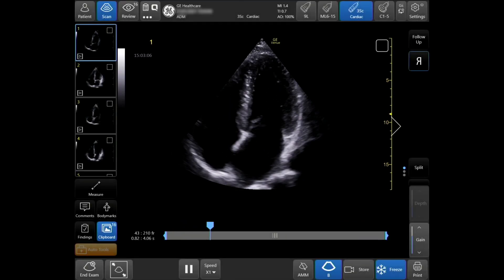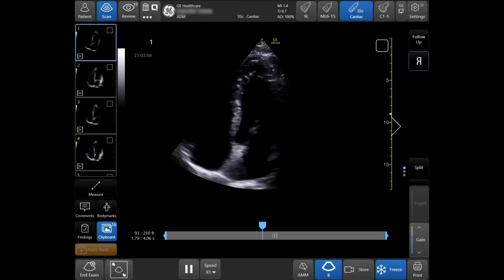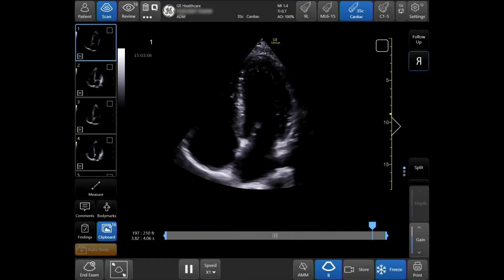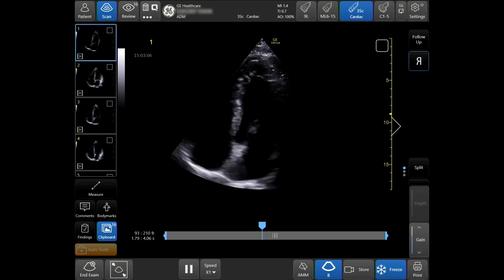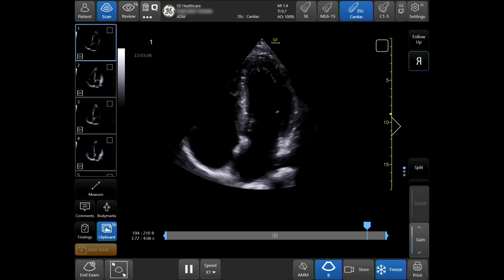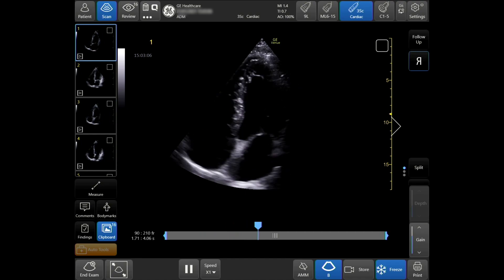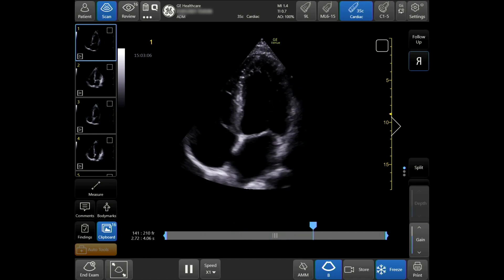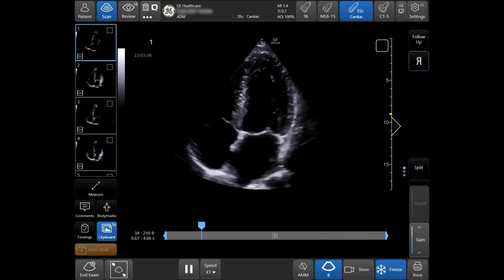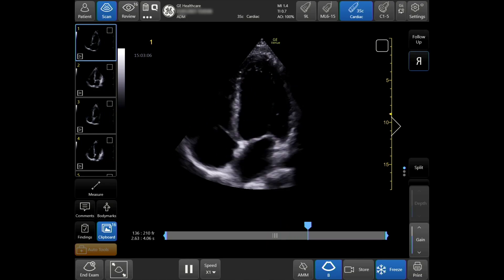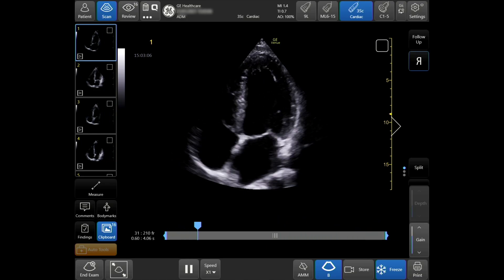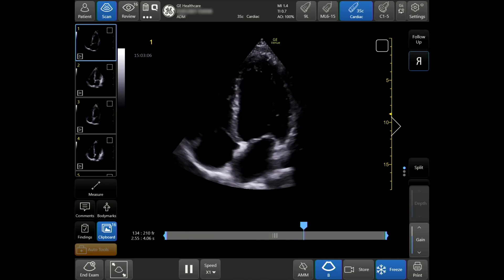Real-time EF is an AI-enabled tool that continuously calculates the ejection fraction during live scanning. Just acquire the apical four-chamber view and tap the icon to see instant, precise results. Real-time EF doesn't even require ECGs for accurate real-time calculations.